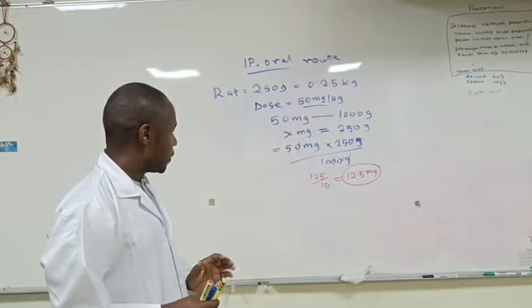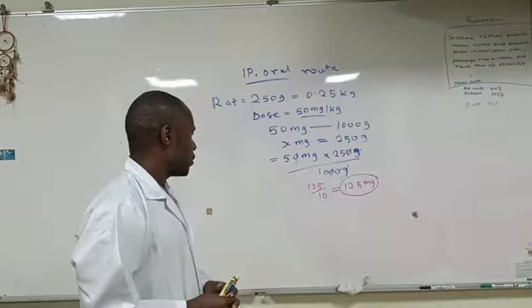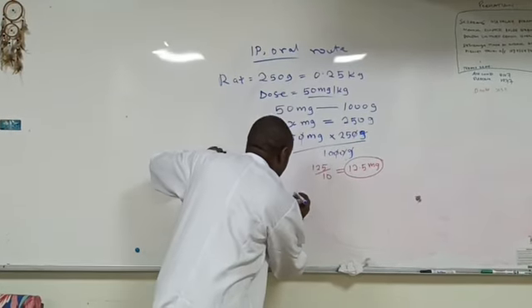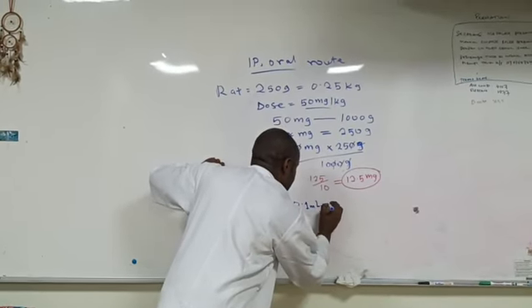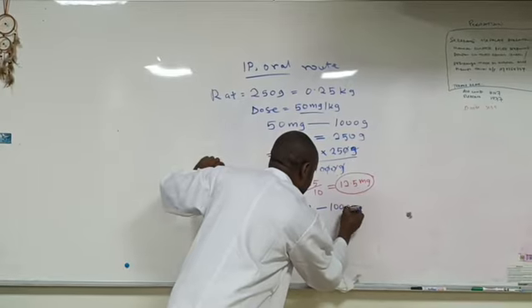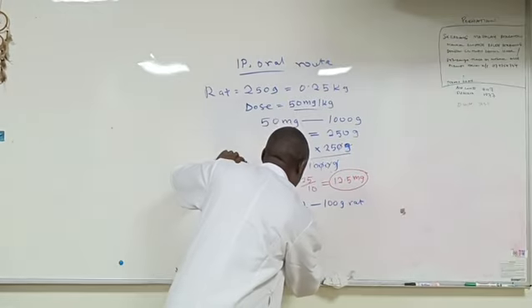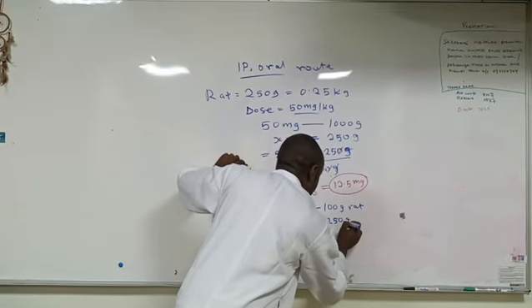But now, how do we administer this, because we want to administer intraperitoneally. Here there is a formula that 0.1 ml for IP is to be administered to 100 gram rats. So now, how much to be administered to this 250 gram rat?